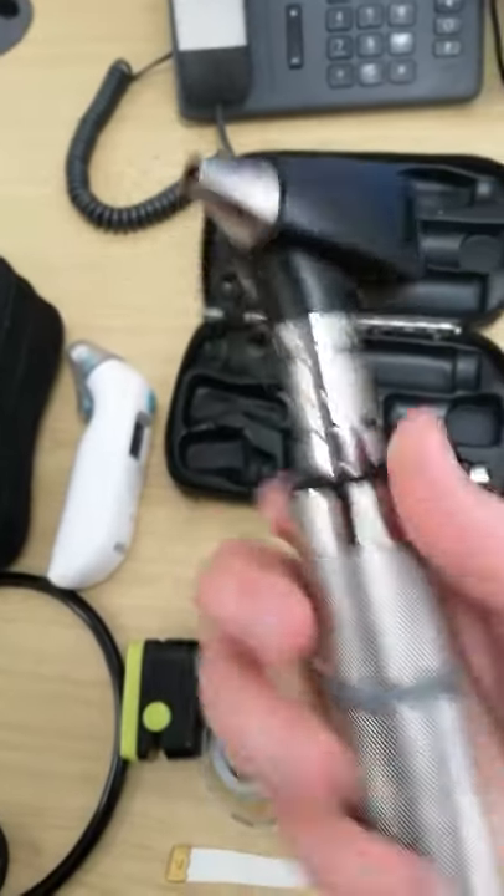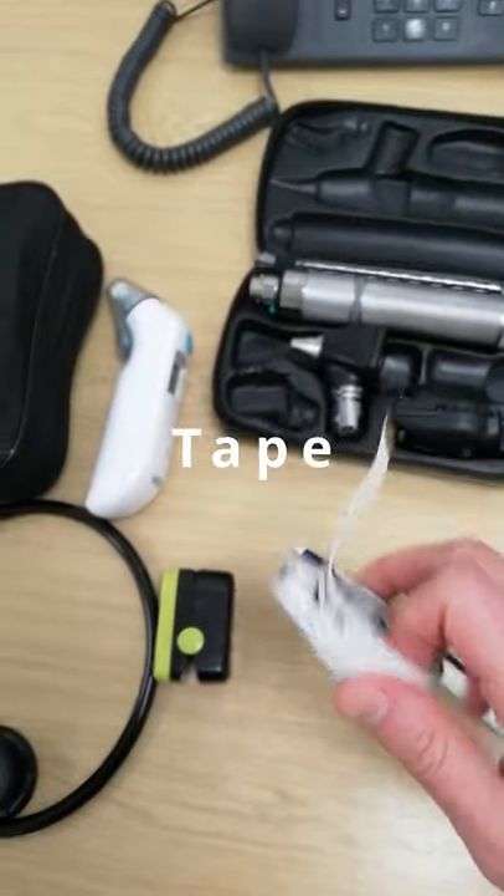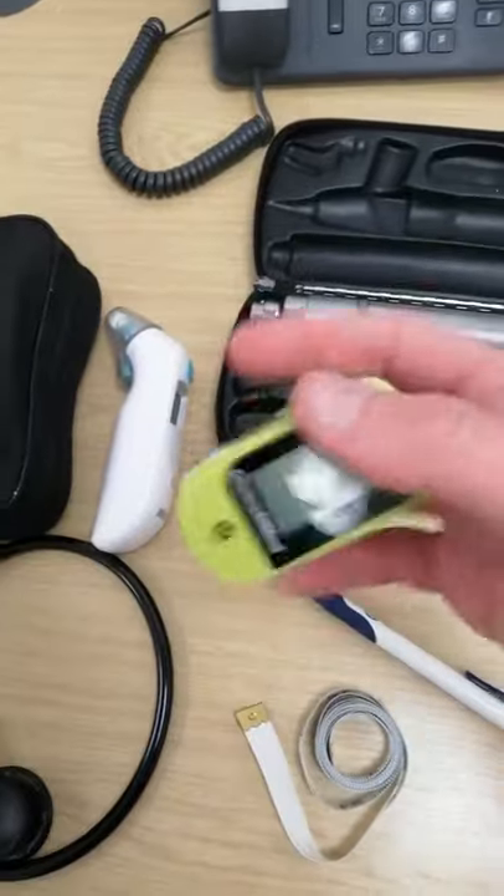The otoscope is a device to examine the ear canals and the eardrum. This is a standard measuring tape. It's very useful, especially when I examine patients with suspected deep vein thrombosis.